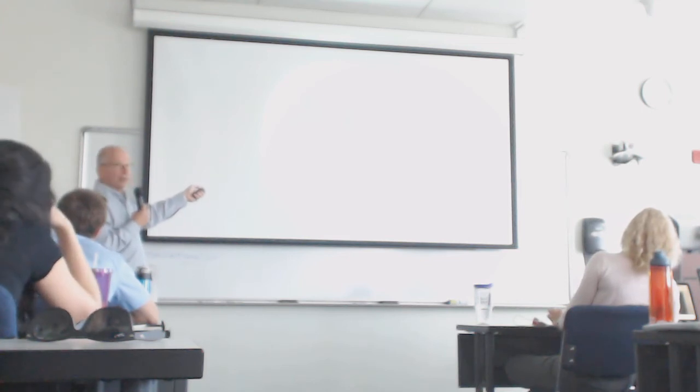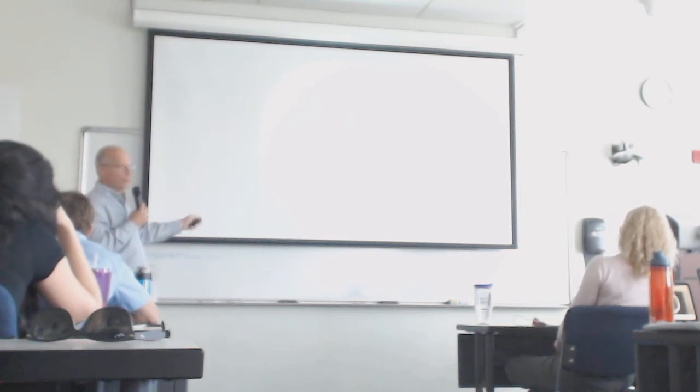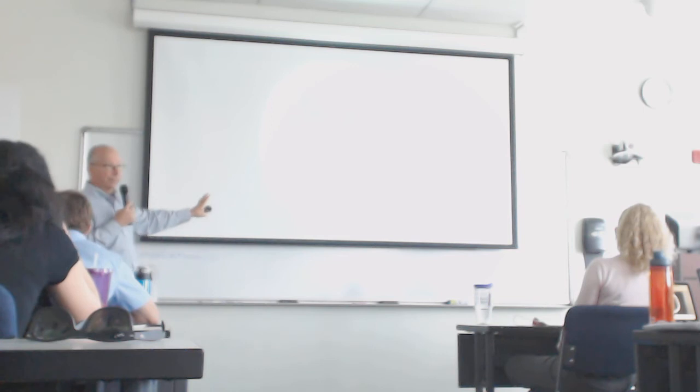This is an ischemic stroke, and there's no hemorrhage there. Right. No hemorrhage. We're all clear, right? This one, while there is no hemorrhage, it's probably too big a territory to actually go ahead and try to treat. So we're just looking at the edema then?